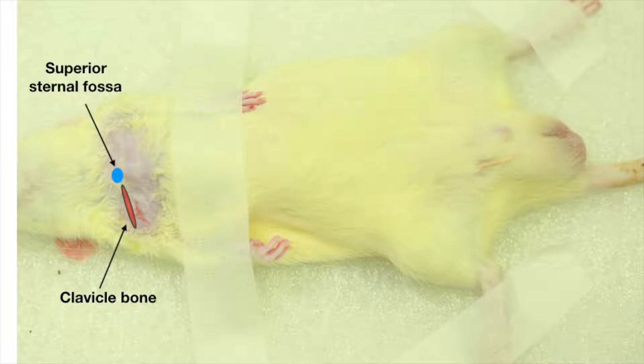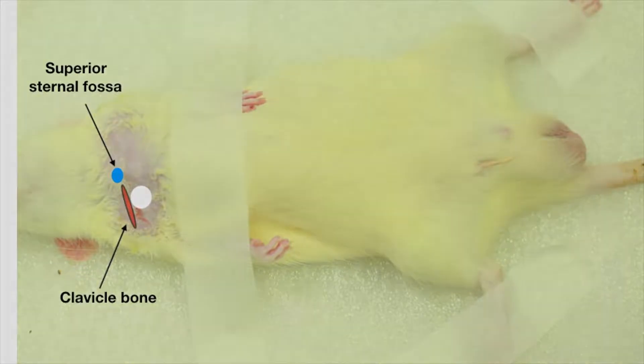Locate the puncture site caudal to the outer one-third region of the clavicle on the same side. The direction of the needle is positioned toward the suprasternal fossa and should be almost parallel to the clavicle, just posterior to it. After blood collection, press the puncture site for one to two minutes to stop bleeding.